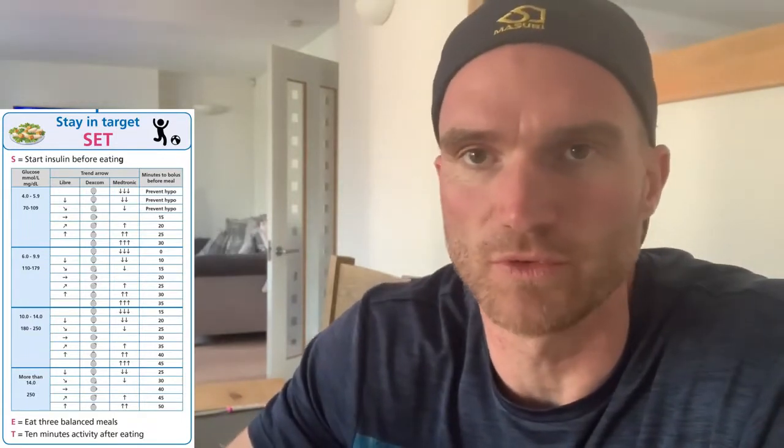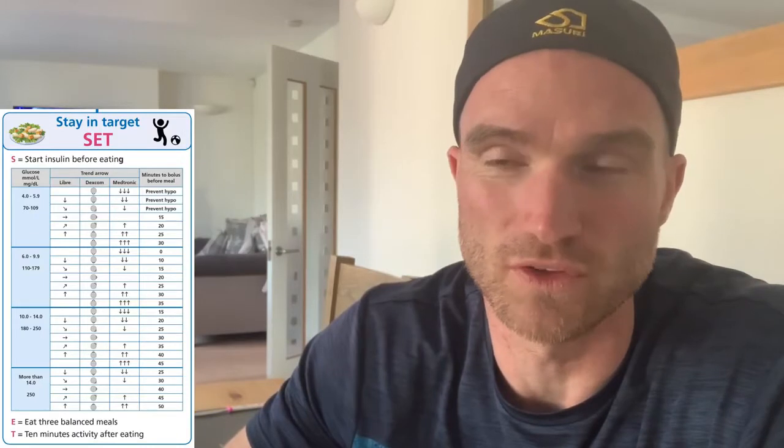Hi Grace and Jude. So this is set in action. I'm just getting ready for tea. I've checked my CGM about 30 minutes before just in case I'm a bit high, but I am 5.2 and steady. So using the chart, that means I need to give my insulin 15 minutes before my meal. It's going to be a balanced meal — about 65 grams of carbs. So for me, on a one unit for 20 ratio, that's going to be about three units of insulin.